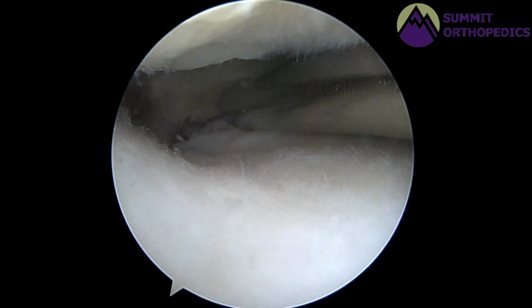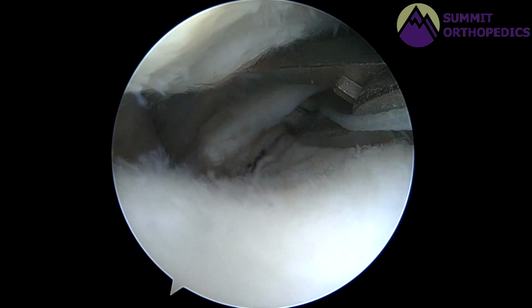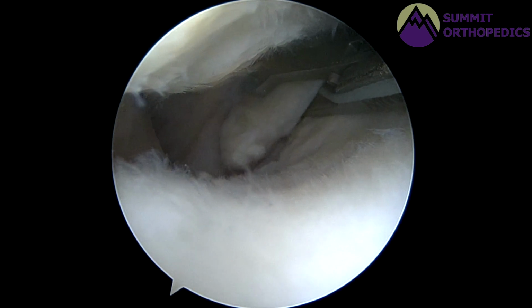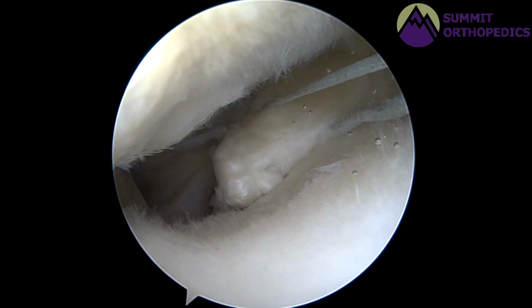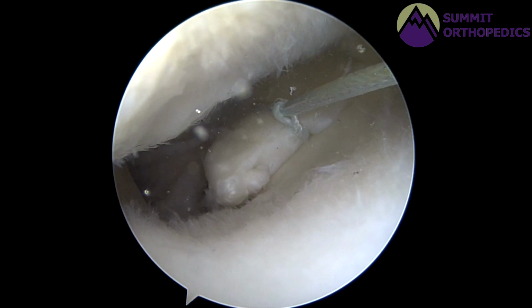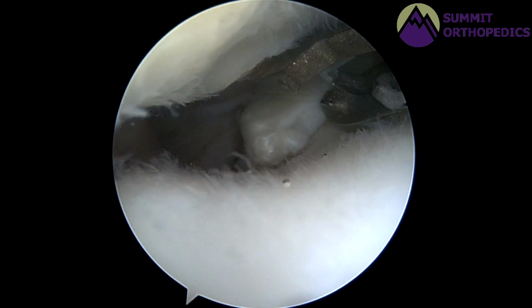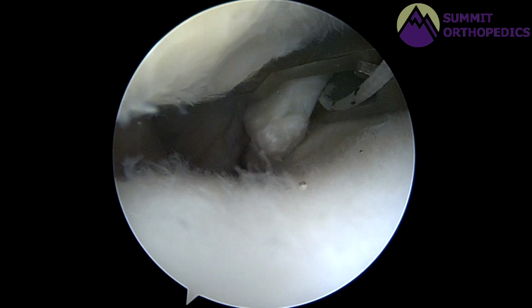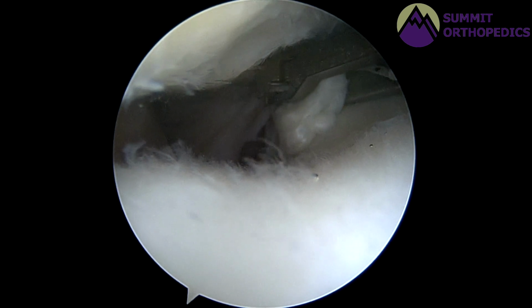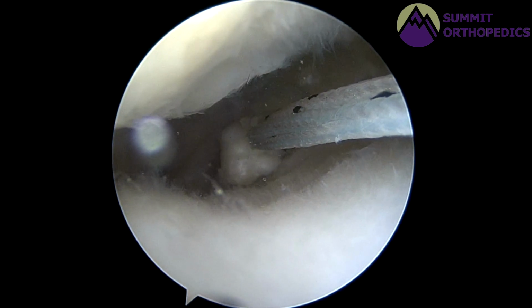Once I clear out all the debris from that work with the shaver, a tool called a scorpion is introduced, and this is able to pass a non-absorbable suture that has a self-locking loop on it, so I can get a good bite of that tissue as seen here. That stitch was passed more medially, and then I pass a second stitch here laterally through the base of the meniscus just adjacent to the root. Those sutures are tightened, and as you can see, they're secured upon themselves.